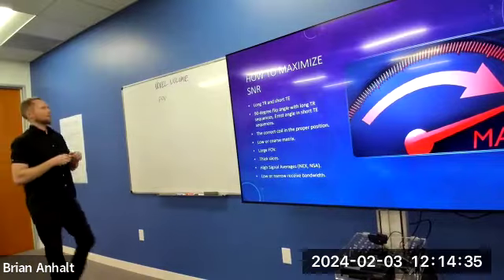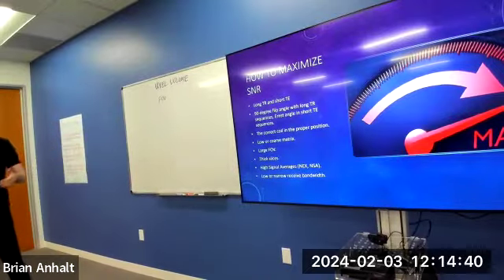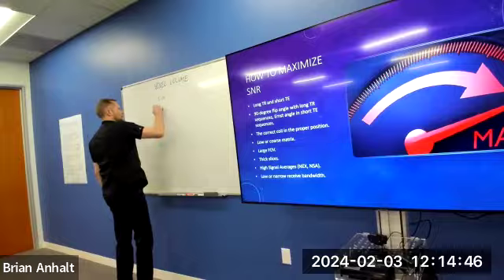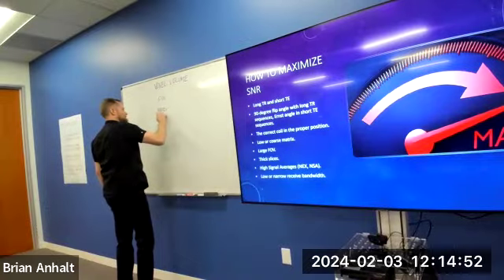Matrix is how many pieces you're cutting that field of view into to give you the voxels that you need to get the resolution that you need. We'll talk about resolution in a second. Matrix is comprised of two different matrices: frequency and phase.